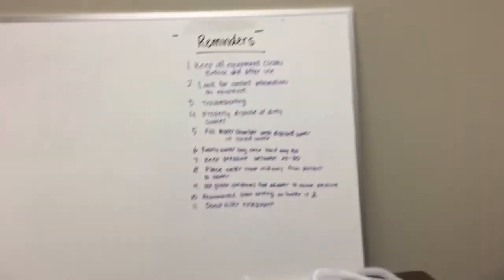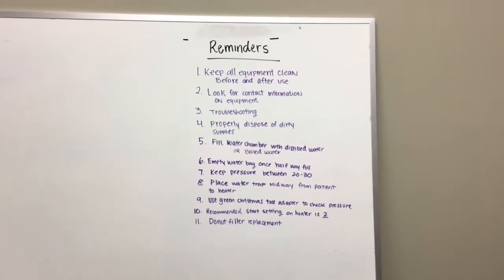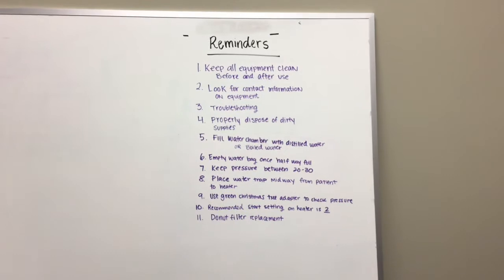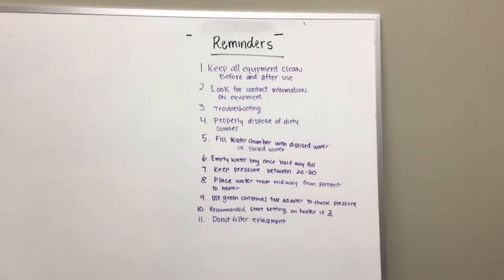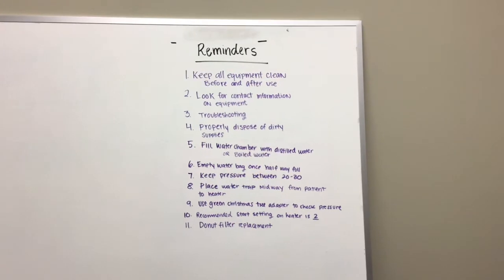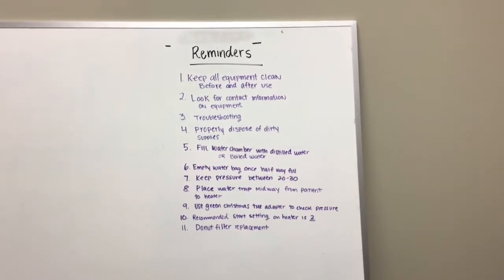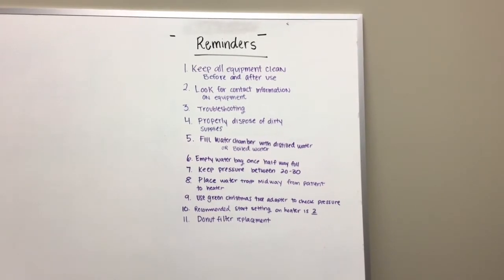Some important reminders is to keep all of your equipment clean before and after use. All of our equipment is tagged with a sticker providing you with information if you need to reach out to somebody. If you have any issues with any of your equipment, please feel free to reach out for further assistance. Properly dispose of all your dirty supplies. Please remember to fill your water chamber with distilled water. If in the event you do not have distilled water, you can boil water. Remember to empty out your water bag once halfway full. Keep the pressure on your compressor between 20 to 30.